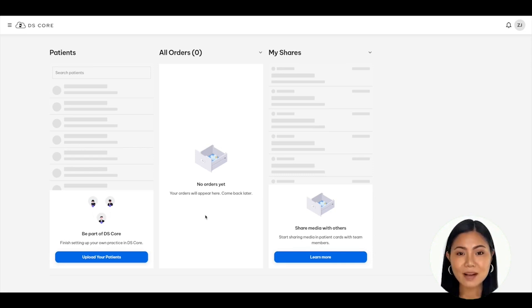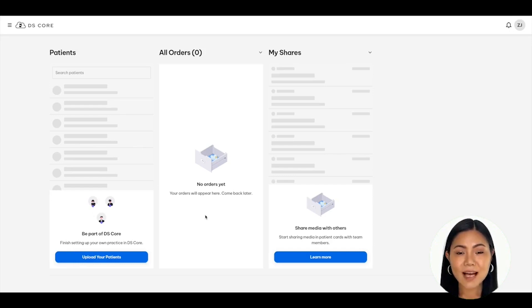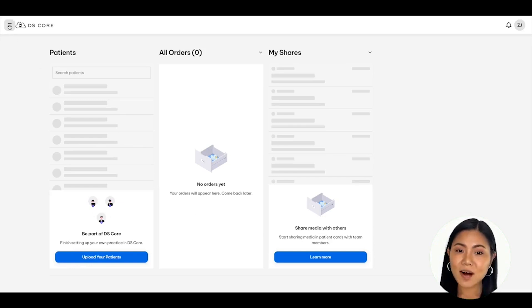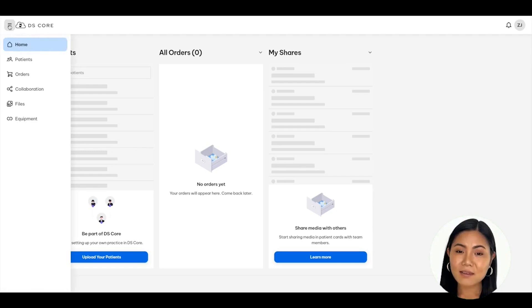Once you have logged into DSCore, you'll see your main dashboard. Navigate to the top left menu bar — the three horizontal lines next to the DSCore logo — and click on the menu to open the drop-down.